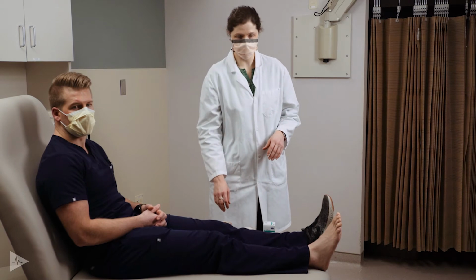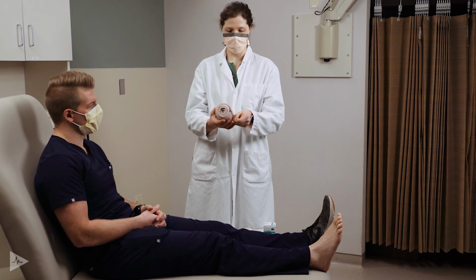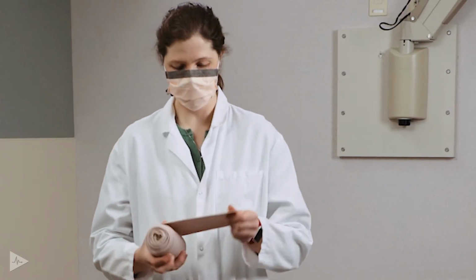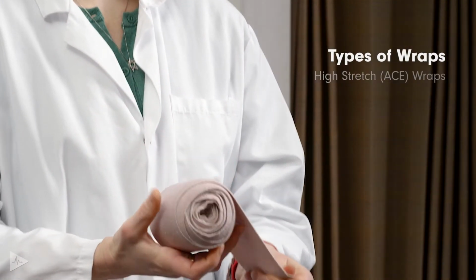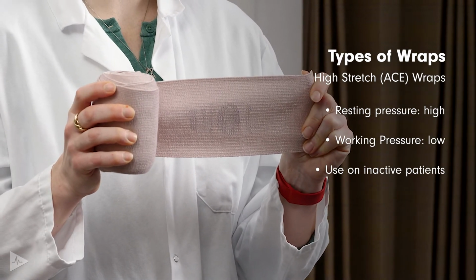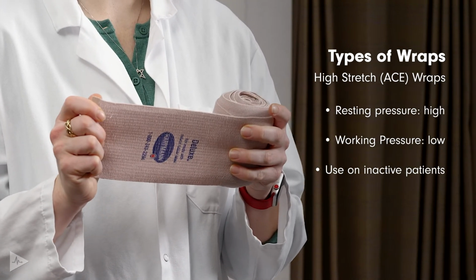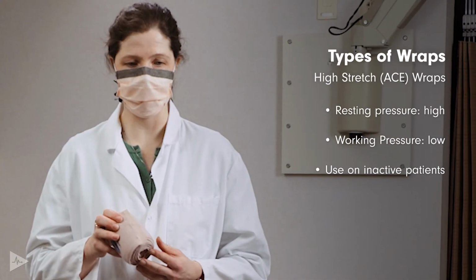The types of wraps for reducing limb girth include the ACE wrap, and so this will be a bulkier wrap. It's called a high stretch wrap because it has a lot of elasticity to it. When you take this out of the packaging, give it a good stretch, and you can see there's a lot of elasticity to this wrap. When this is placed on a patient's leg, we will have a high resting pressure because of the elasticity in the compression. But when they are up and walking around, we have a low pressure because this elasticity will also give as they're flexing their calf and walking around. So we tend to use this on inactive bedbound patients.